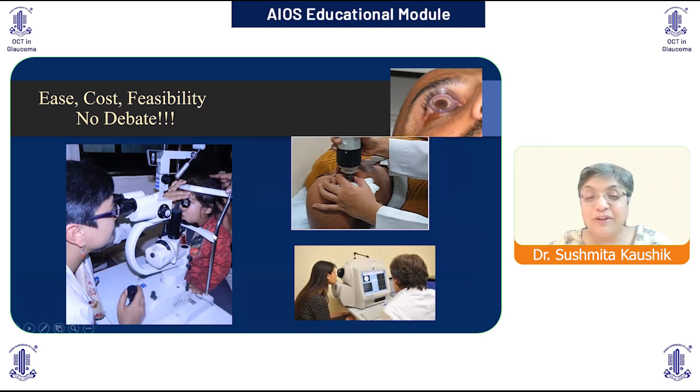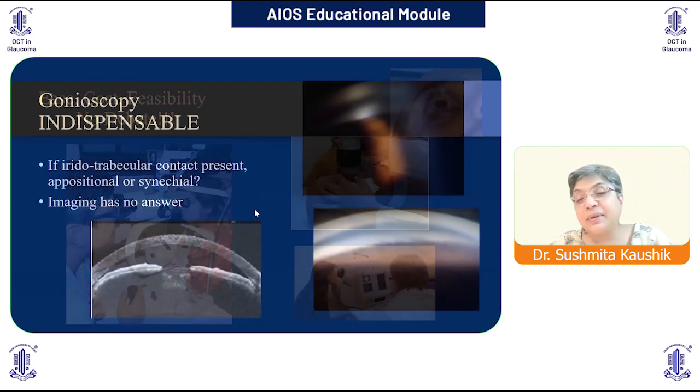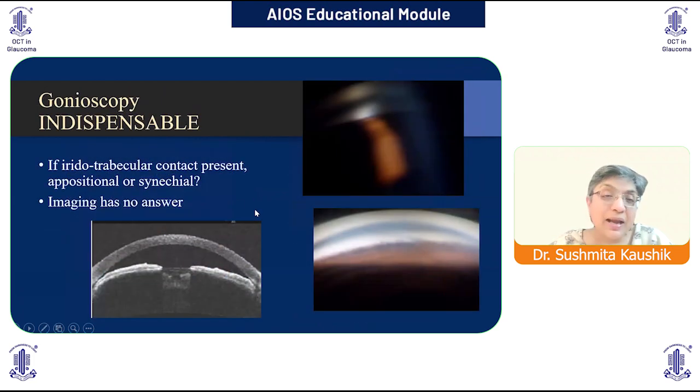This is one of my favorite pictures. I've shown it so much. This 3-year-old girl also lets me do a gonioscopy. So there's no question compared to putting in an eye cup, putting distilled water, a big probe of the UBM, and this expensive big monster of an AS-OCT, and depending on that, this little device that we have.